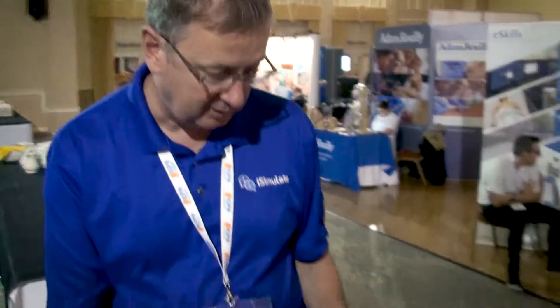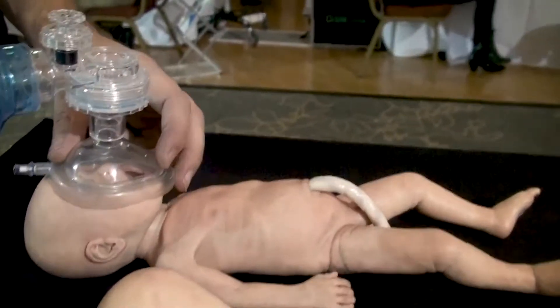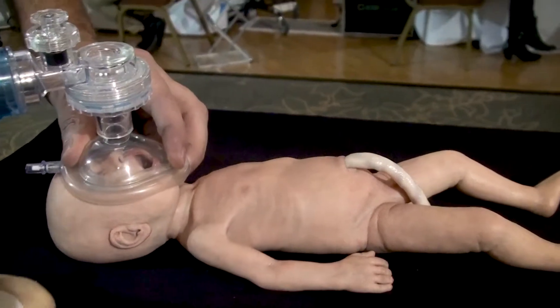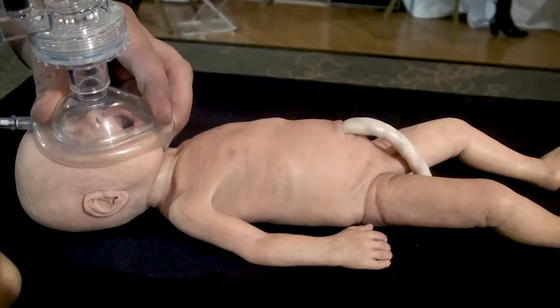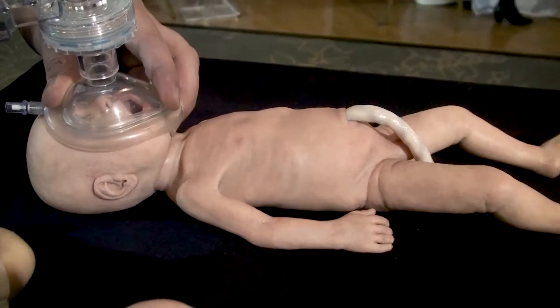We can do the same with the little preemie here. I'll turn the bag valve mask around the other way and cup the face, do a little bit of a head tilt — and again you can see that the movement we're getting is the same realistic movement that we would get in the real infant. We're just doing enough to get some movement, and obviously not over-ventilating the child.